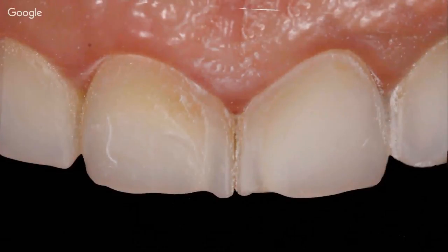This picture shows you the result after sandblasting immediately. No prep whatsoever. I just sandblasted the teeth. Again, you can see something simulating or looking like a finish line, but that's due to the erosion. After sandblasting, you can look really at the tooth surface and you can see how dull it looks. And that dull surface is just a perfect surface for bonding. When I see this, I'm really happy and satisfied.